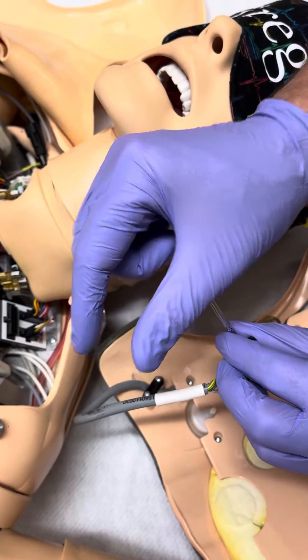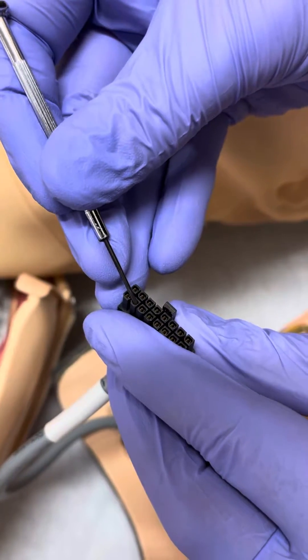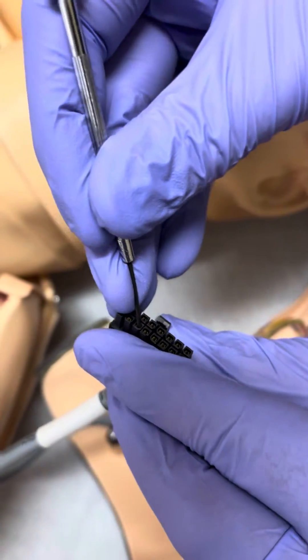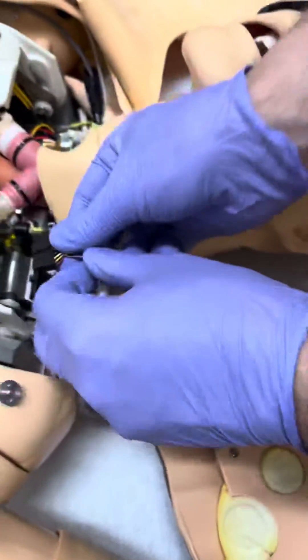All we're doing is taking that square piece and closing it because it's going onto round pins. Each one of these I'm going to slide in along the plastic and close each one of these pins. Once all those are done, we slide the connection back on.